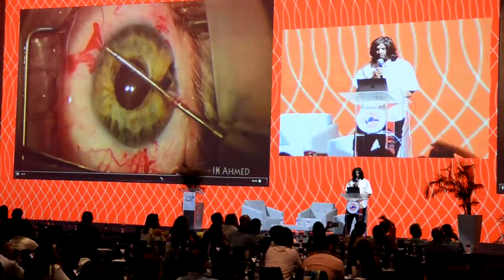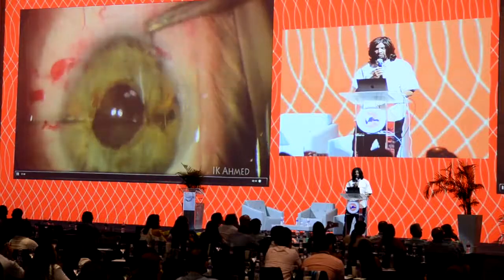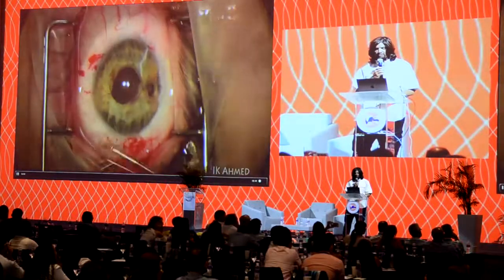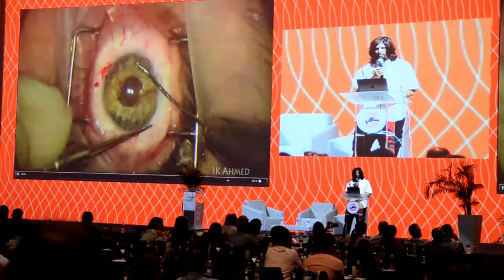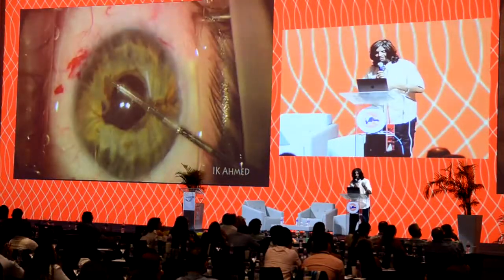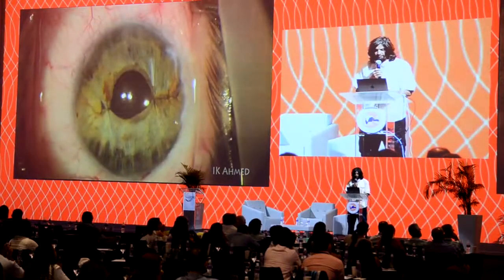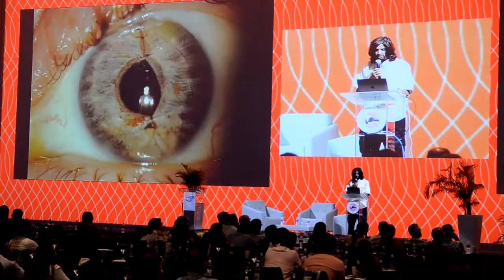Okay, so you're getting the hang of it now. And you see the pupil is becoming rounder. We'll basically do another pass here, closing the pupil there, one more pass there. Again, both ends out of the eye, loop around with the micro tyer and slide it in. Typically a 3-1-1 knot is used at the cut. And there's the appearance post-op.